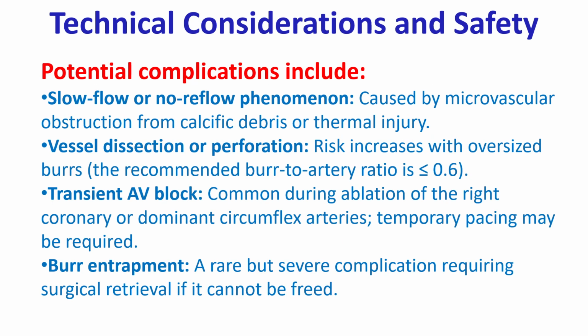Potential complications include slow flow or no-reflow phenomenon caused by microvascular obstruction from calcific debris or thermal injury, vessel dissection or perforation. Risk increases with oversized burrs. The recommended burr to artery ratio is 0.6 or less.